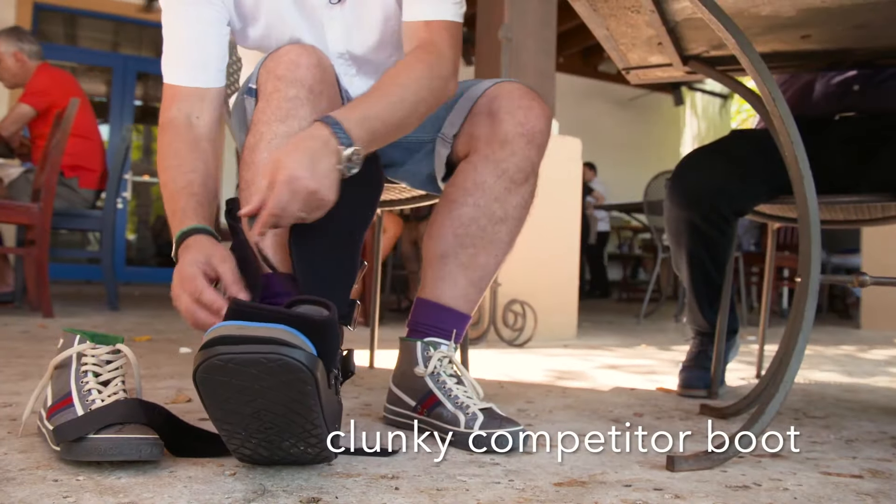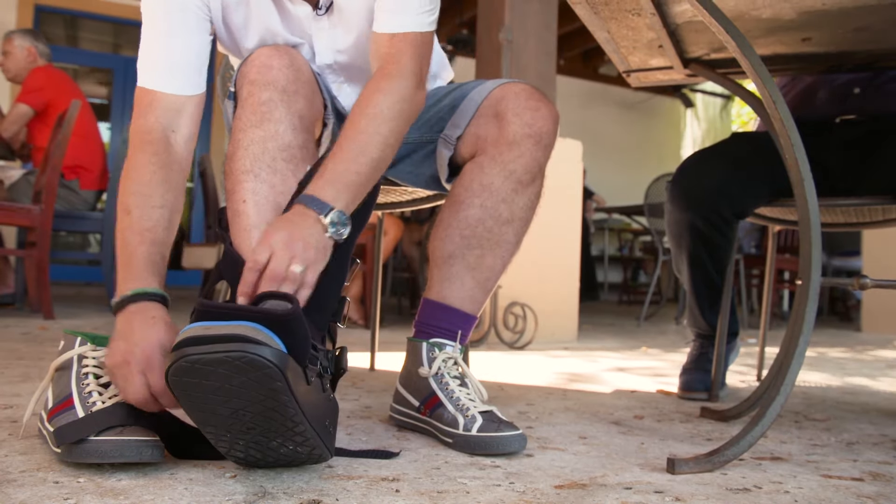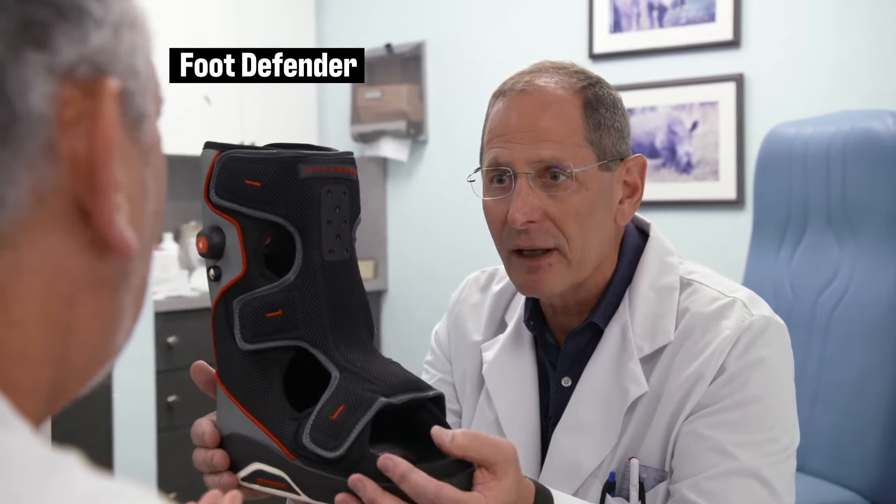Clearly something's not working, and part of the impetus for us to take action was to come up with something that not only worked better but was more patient friendly. So Jason, this is the Foot Defender — specifically designed to protect the diabetic foot.